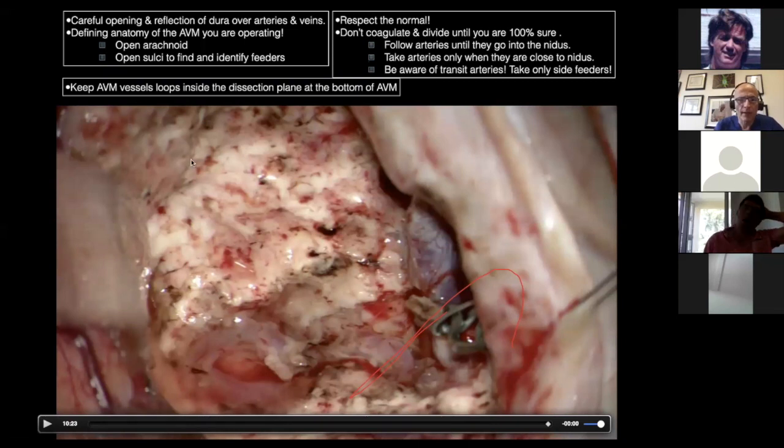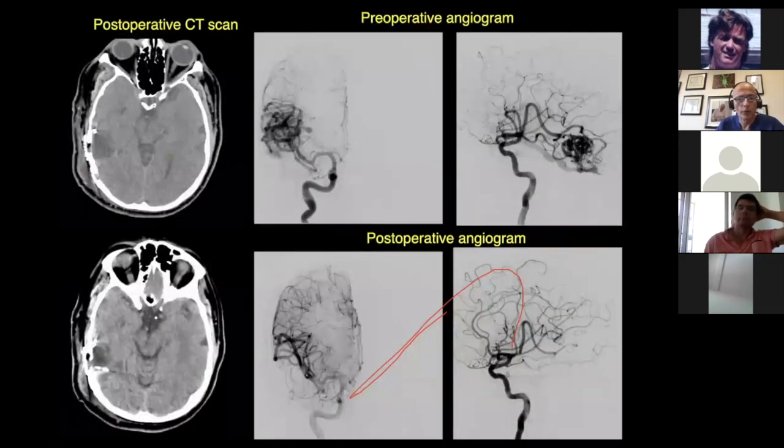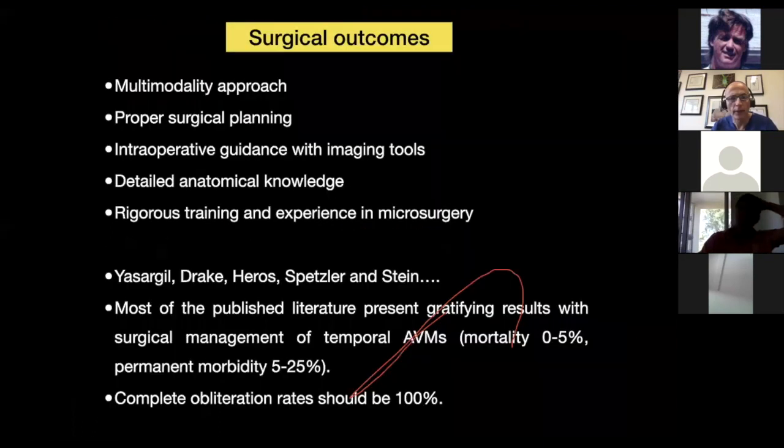If you start having the bleeding, two things, either you didn't do good hemostasis, or most importantly, you left the residual nidus, okay? This is a technique I learned from Roberto Heros. I always stop, dry everything, and wait 15, 20 minutes, and ask the anesthetist to raise blood pressure to 150, for example, if the blood pressure is 120 normally, okay? So good satisfactory results, good mRS score. He was discharged home. I like to keep them in the ICU a few days to make sure they're not having blood pressure swings. And once I'm comfortable, I send them home.